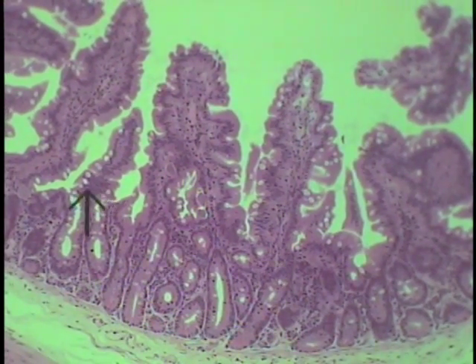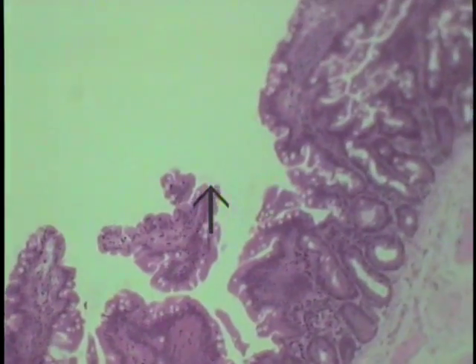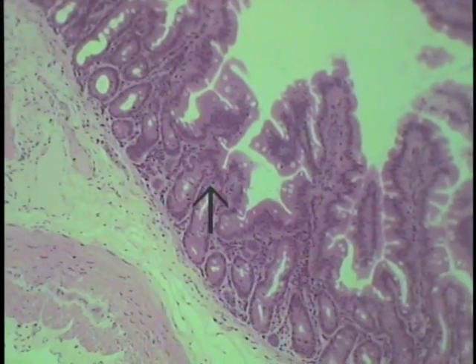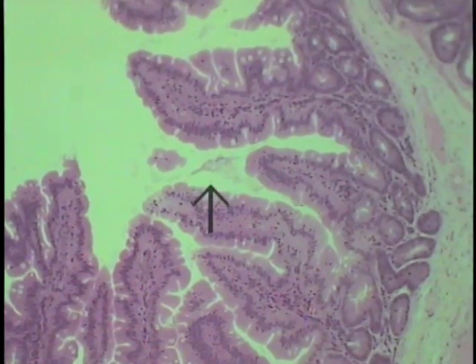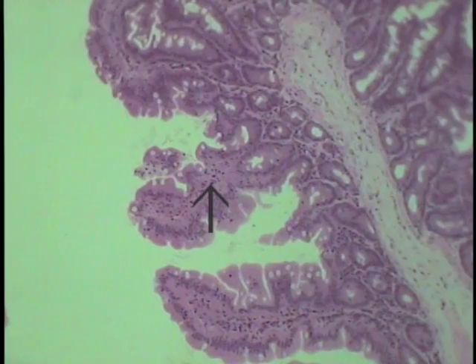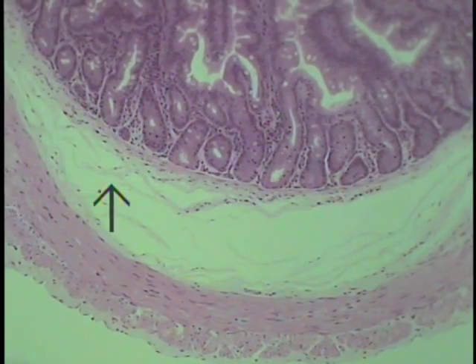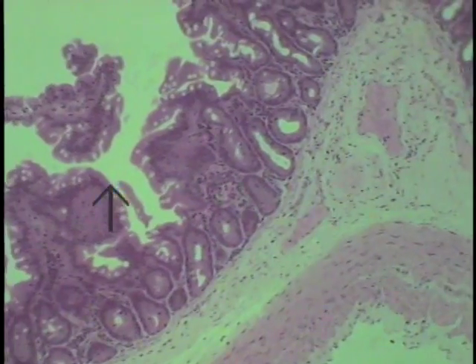Note the number of goblet cells in this intestinal mucosa covering the villi. I think one can reach the inescapable conclusion that they are roughly the same. Probably the same number of goblet cells in this mucosa, that is the jejunal mucosa, as was observed in the intestinal mucosa of the duodenum. But a feature that's missing within the submucosa are Brunner's glands. There are no duodenal glands in the jejunum, as illustrated by the field as we are coursing along.